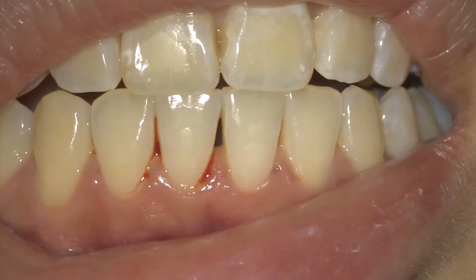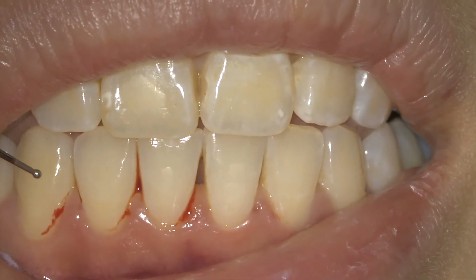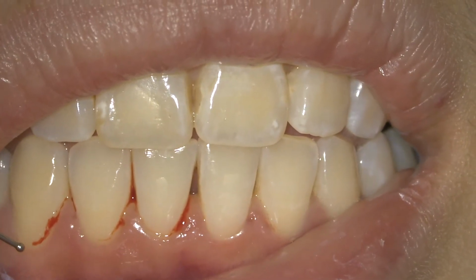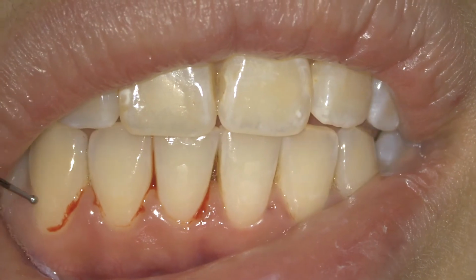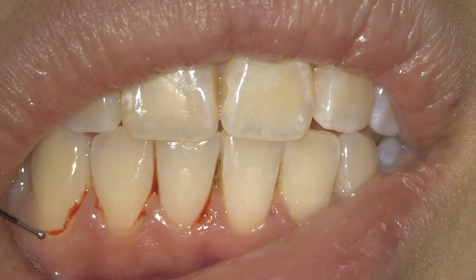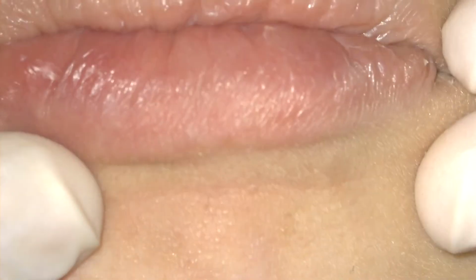Okay, now you can see there's nice bleeding popping up, as you can see here. Yes, it is trying to flow from the papilla to the marginal gingiva, right? It has not completely flowed, but it is trying to. So this could be a score of 2 also, because there's a papillary bleeding point here and here, and it is also flowing. So this can be considered a score 2 bleeding. In this fashion, you evaluate the severity of bleeding perceived in the patient.